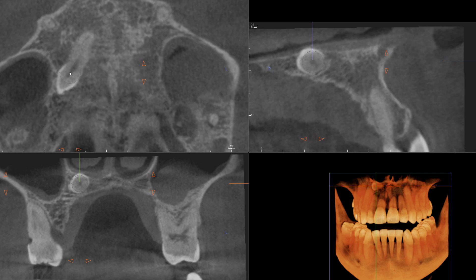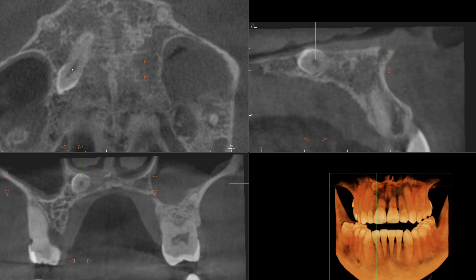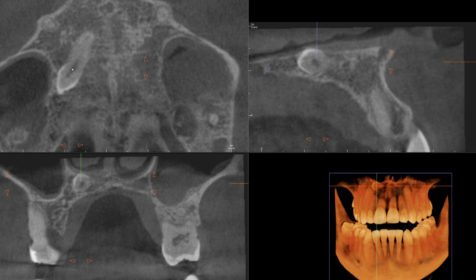Not only is this tooth ankylosed, but also if you are wanting to get this tooth out just because it's a supernumerary, I don't think there's a need to do that. It hasn't caused any complications to the surrounding dental structures — it hasn't caused impaction, prevention of eruption, or root resorption. The only thing that may be important to recognize is there may be disruption of the floor of the nasal cavity.